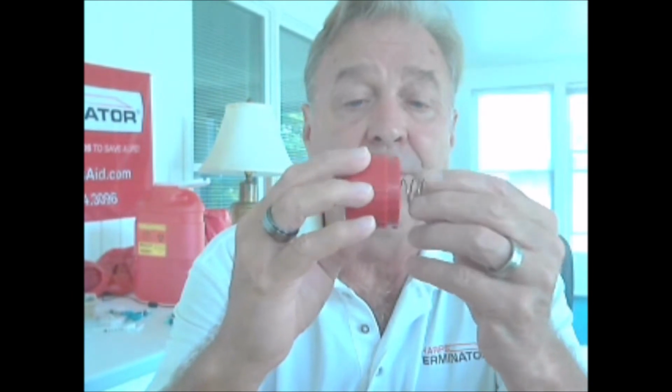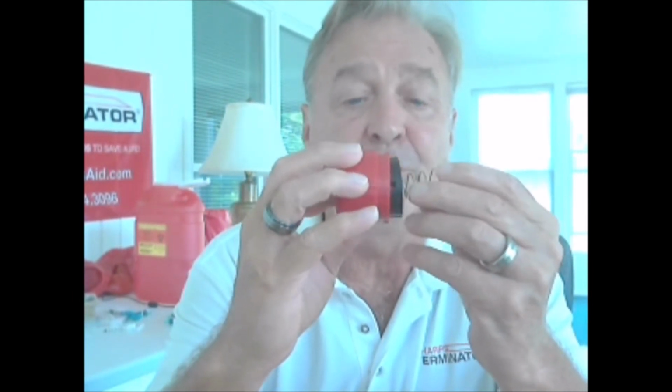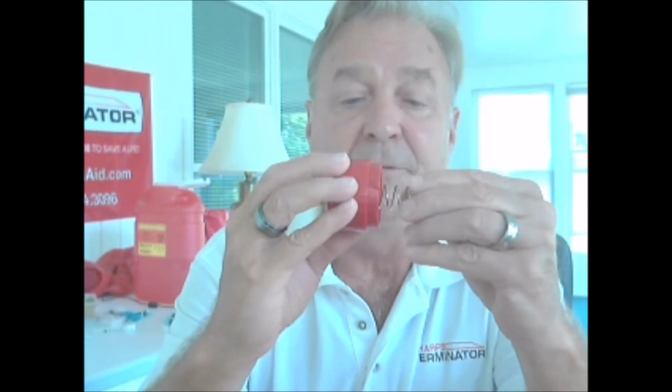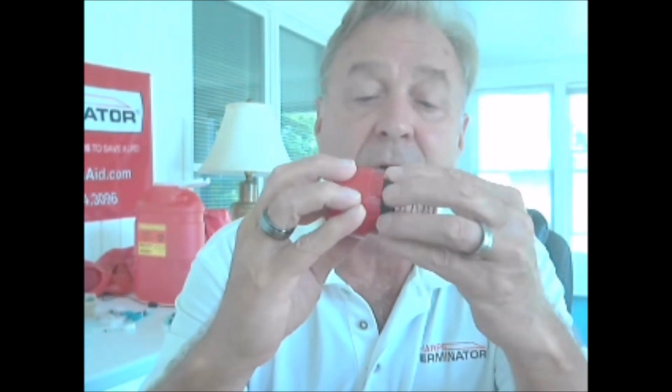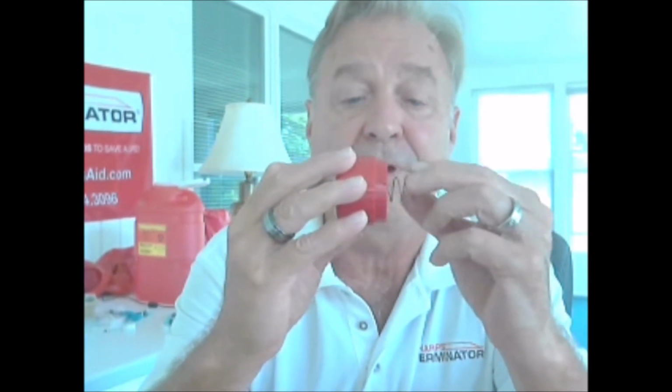All right, so that's not installed properly. You want to have ease of movement here. So this slides freely so that you won't have any issues when you insert the needle. It's going to glide smoothly. So I'm finding the notch here. Okay, now that's not giving me freedom of movement here. So that's not the correct configuration there. That one is. Okay, so that's slid in perfectly.